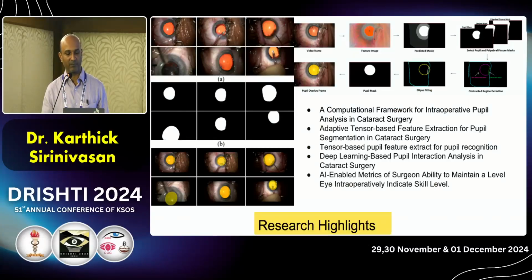So moving on to surgical expertise with AI, in collaboration with the Nalasamy lab at the University of Michigan, we are trying to know what steps you do regularly in a regular format. If you have a standard operating protocol for SICS saying that you have a 7 millimeter incision in a frown shape, are you making that incision exactly 7 millimeters? Are you going 6 or 8? Is your pupil during your PCR shrinking, or is it widened enough to know that you don't have a PCR? What is your strategy when you do a phaco chop?